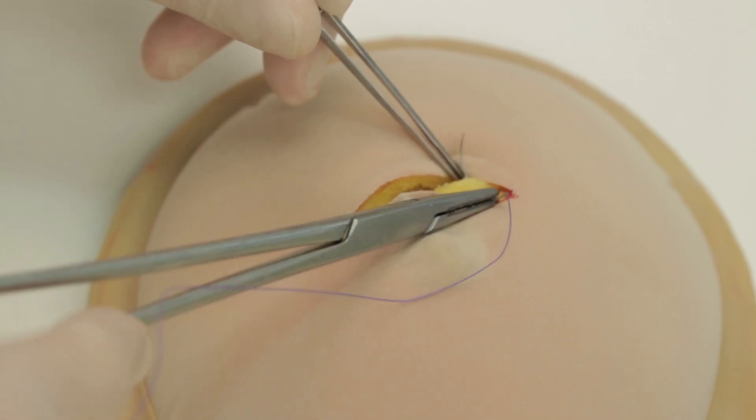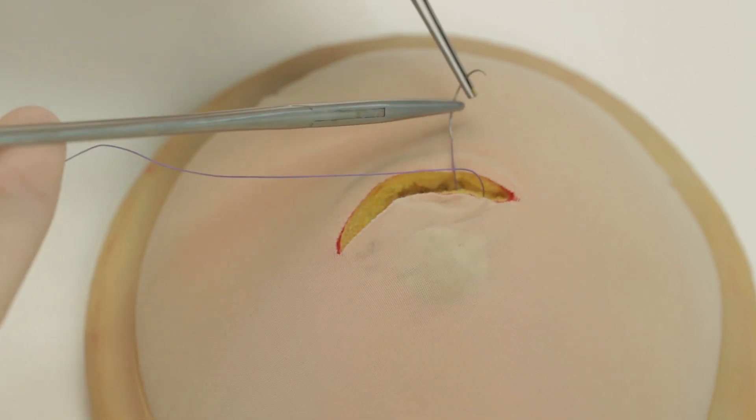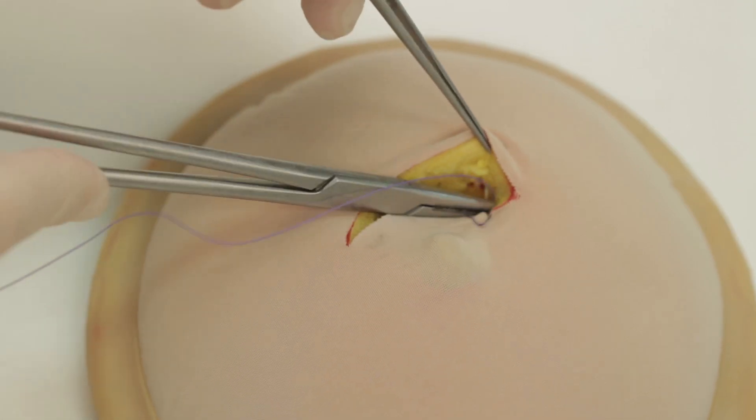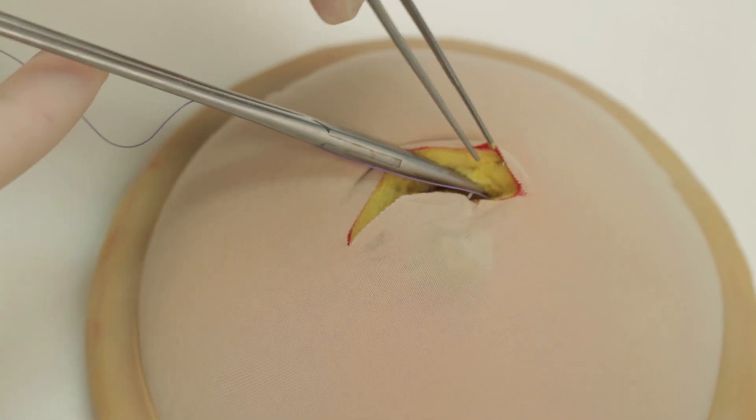In vivo, once haemostasis has been secured, the defect can now be closed. In this instance, the dead space is closed using interrupted 2-0 Vicryl sutures.